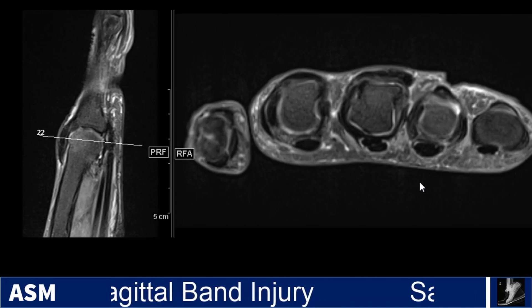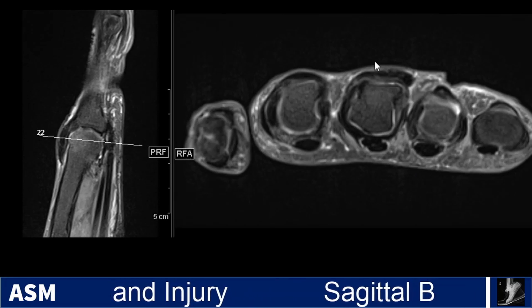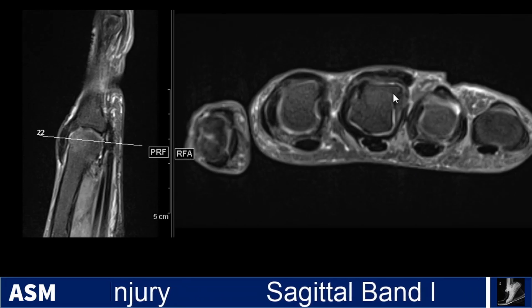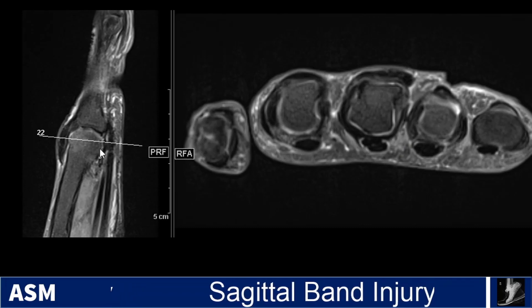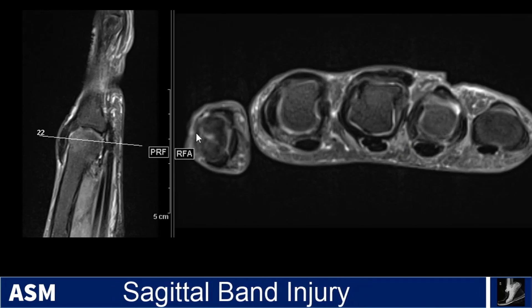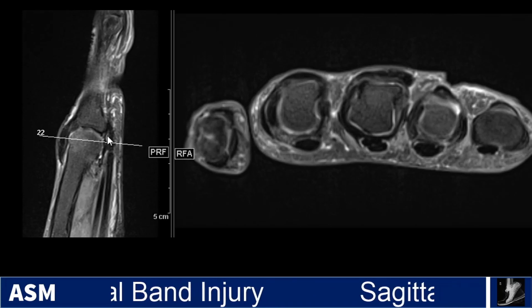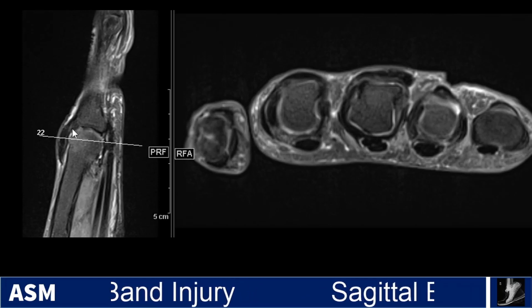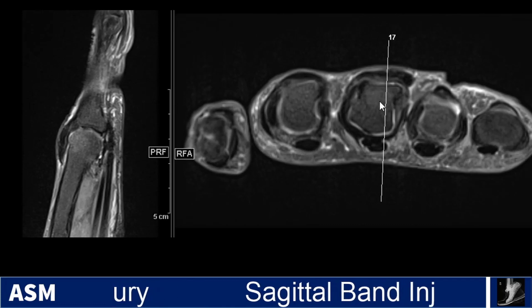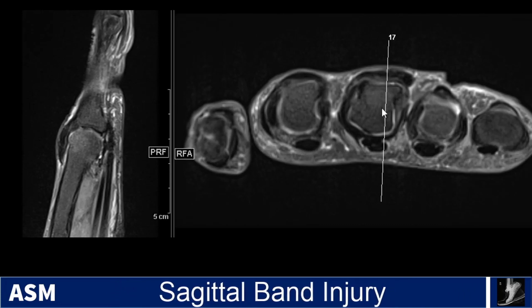We're going to begin with the axial proton density fat suppressed image here on this side and the corresponding sagittal proton density fat suppressed image on this side. You can see the cross reference here. We are at about the level of the dorsal aspect of the metacarpal head. This is the third digit, which is the affected digit for this patient.